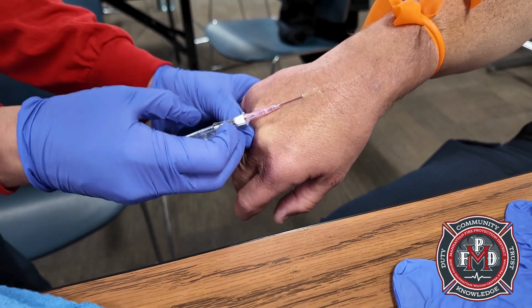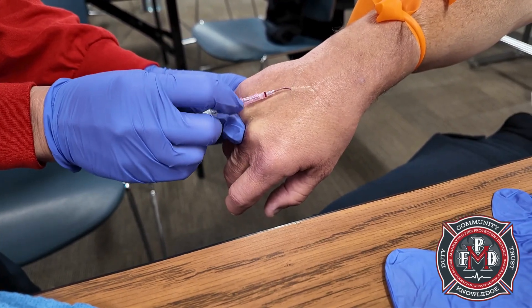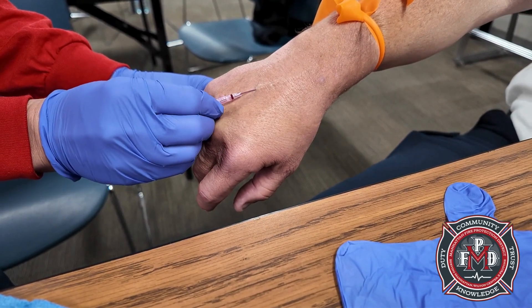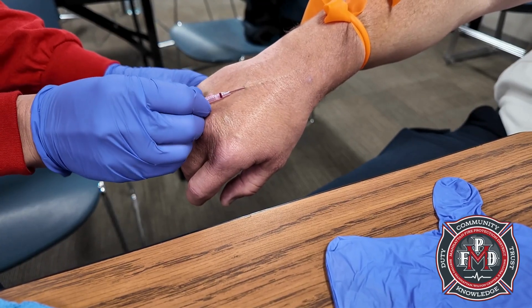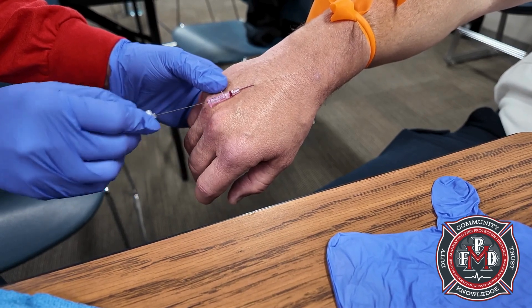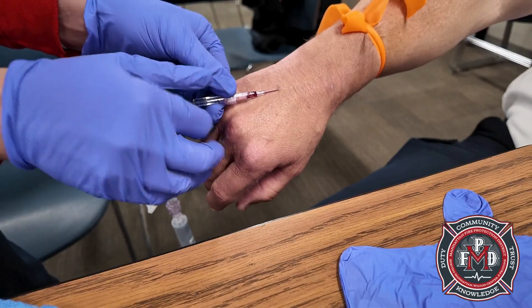The flash goes all the way down into the chamber. We're right up against the valve — you can move the catheter and see that it's in the vein. We're going to retract the needle. We don't want to keep pushing through because we might blow it, so we're going to connect our flush and pop the tourniquet.